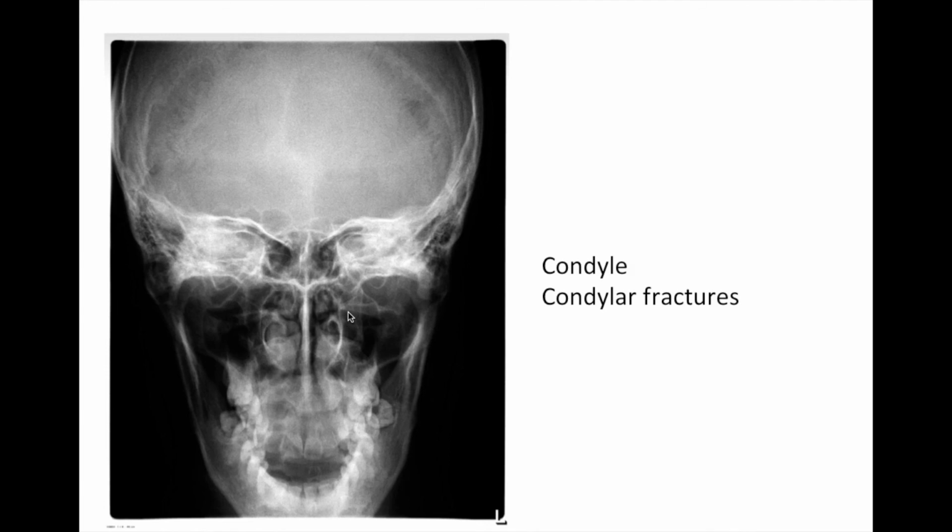This radiograph is prescribed when we have to view the condyle and its fractures. This is the condyle.